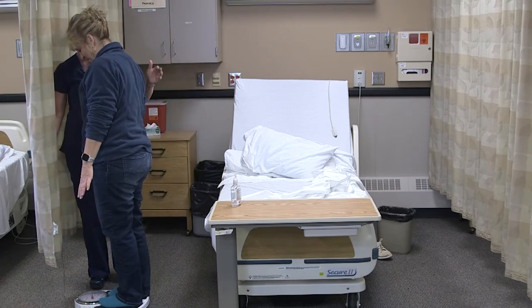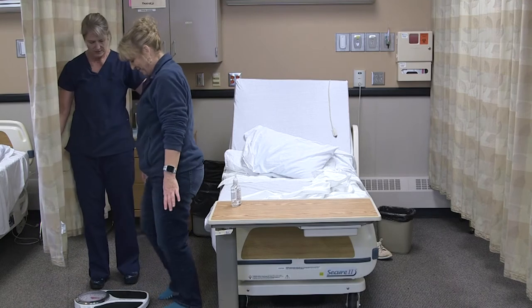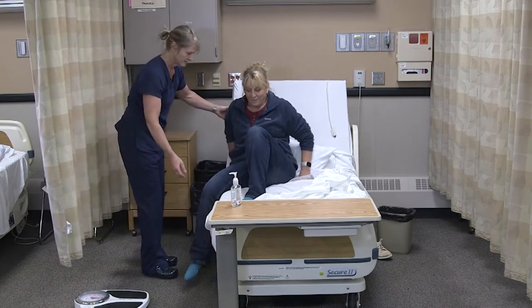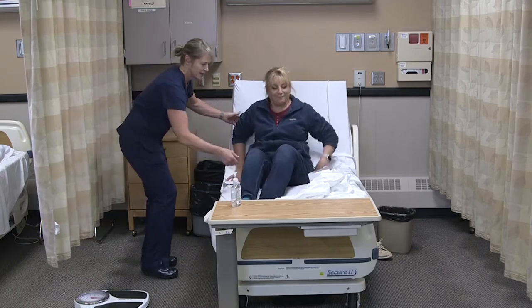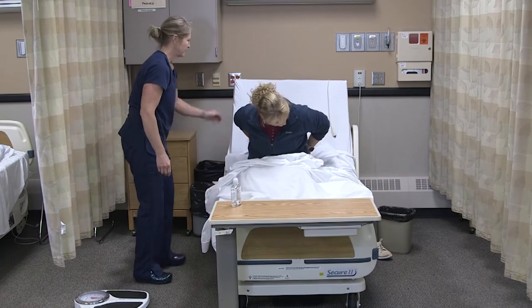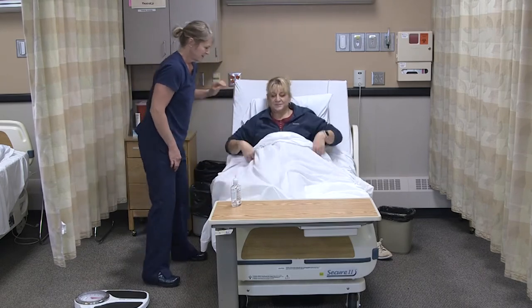I'll have her hold for just a second, then she can step off. You can have a seat back in bed. Do you need any help getting your legs back in? I'll get you comfortable again.